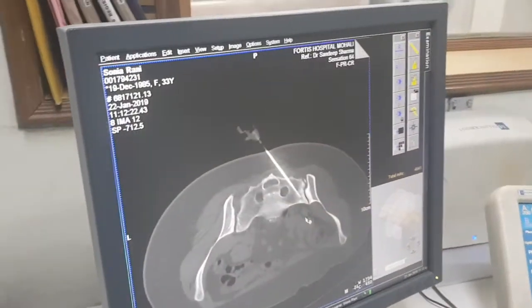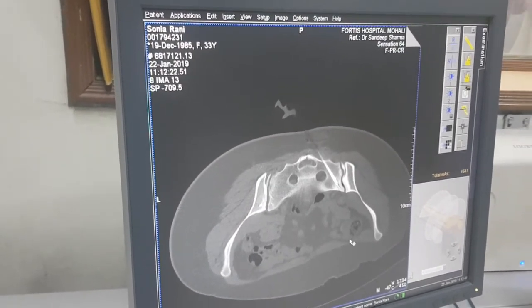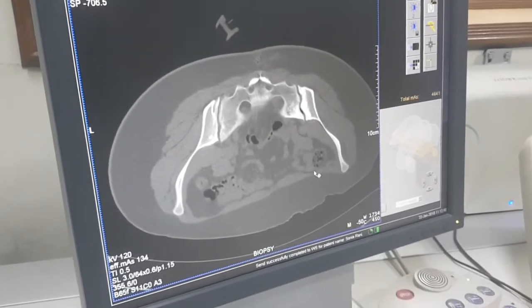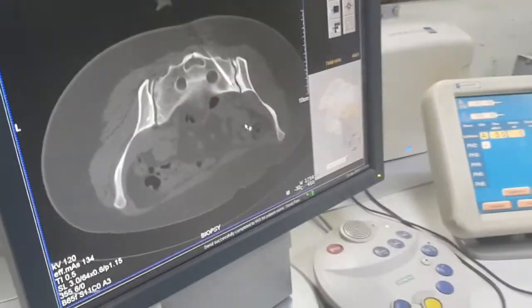We have reached almost that sclerosed part and it's giving a lot of resistance. So I like to go in there, and there is some air in that sacral joint. So it was very likely that this is degenerative.